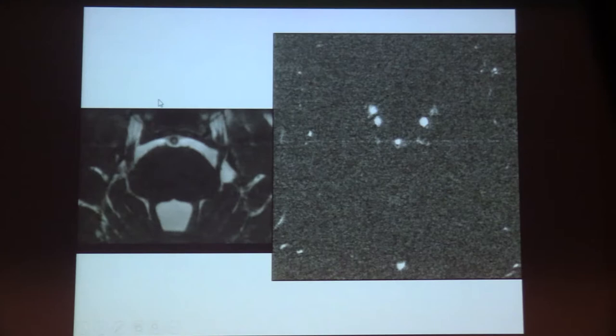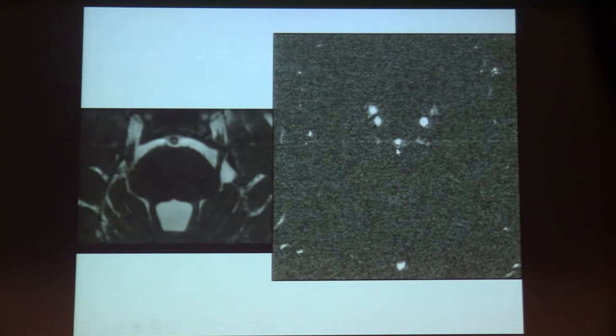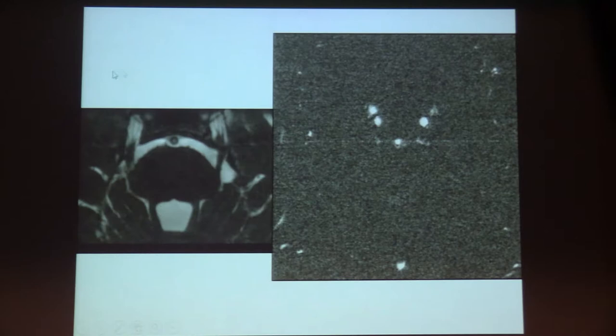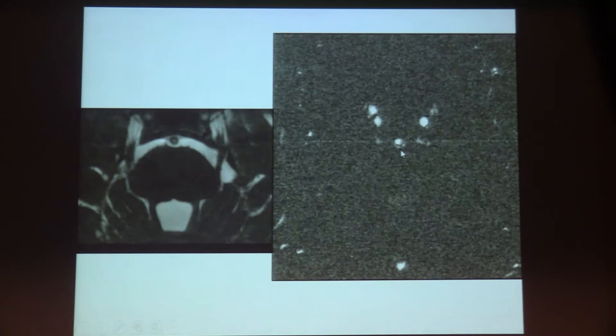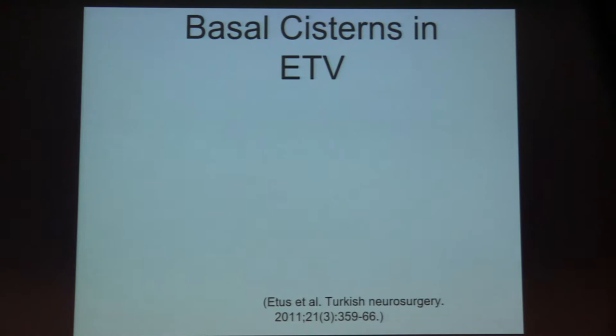Occasionally when I can catch one of these patients on the scanner, I'll sit down and scan them myself. Here's such a patient — the anteropontine membranes are displaced medially. On the standard axial T2-weighted image, you might think there would be CSF flow ventral-to-caudal through that entire fluid-filled space, yet on cardiac-gated phase contrast imaging we can see biphasic flow just in that now-constricted area right around the basilar artery, right in the prepontine cistern. We think that reflects the major outflow tract of the posterior fossa.